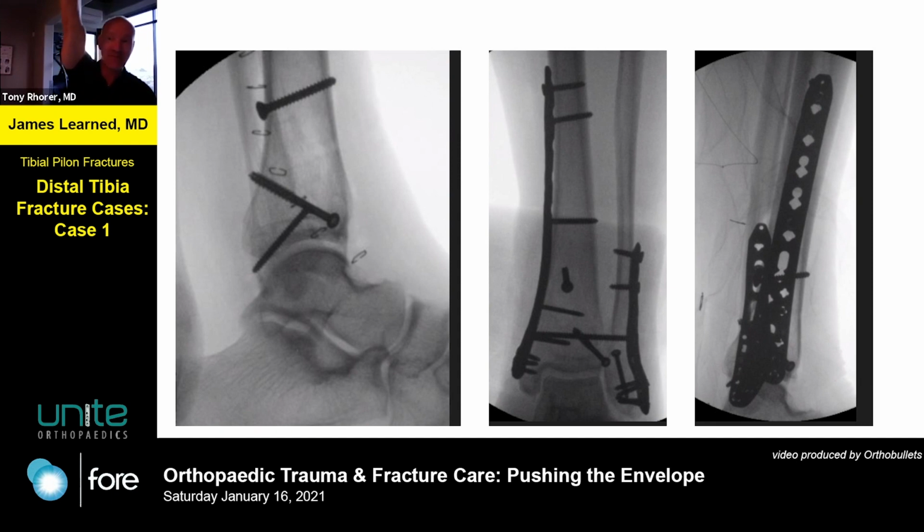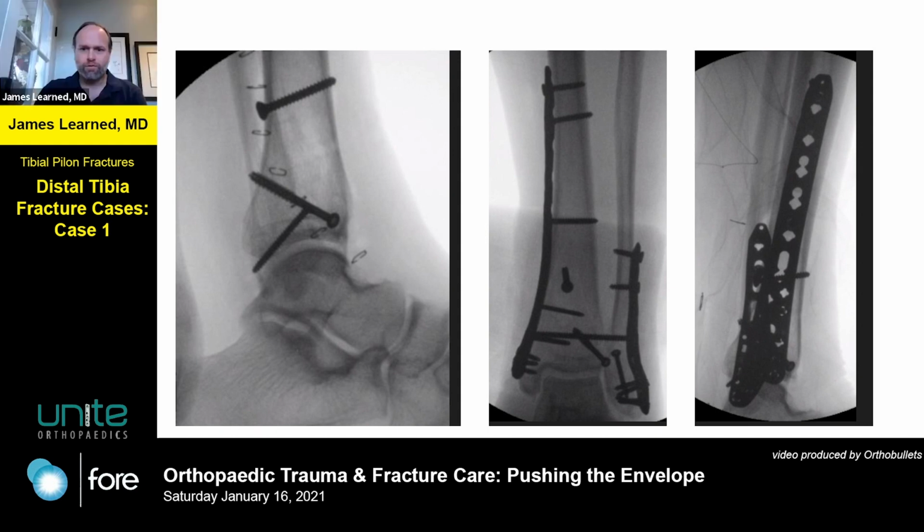Did you have the foot up in the air like this in the OR? Did you do the patient lateral? Because that's a tricky screw. That's not something everybody could do, I don't think. And it's not even a cannulated screw. It's a solid screw, so that means you pre-drilled it and popped it in there. Those are, I think, every discussion point that I wanted to bring up, you brought up.